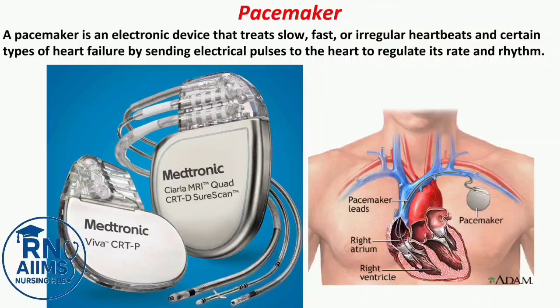Pacemaker. A pacemaker is an electronic device that treats slow, fast, or irregular heartbeats and certain types of heart failure by sending electrical pulses to the heart to regulate its rate and rhythm.